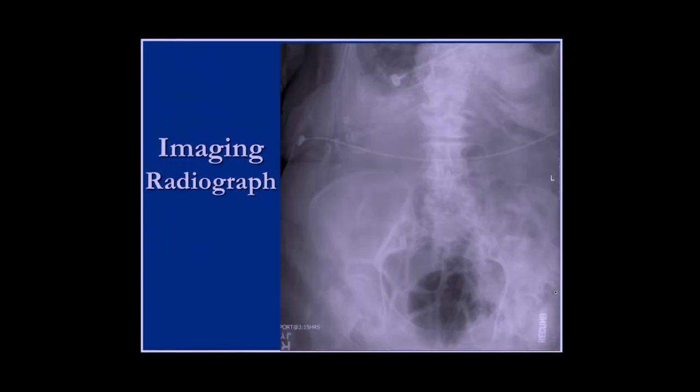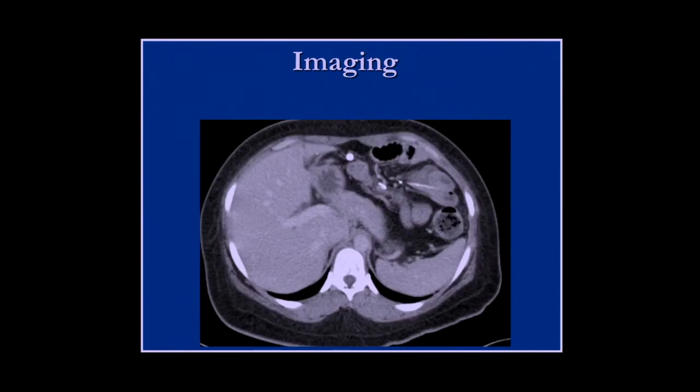So let's go through an imaging sequence of the body using each of these techniques. If you just do a straight X-ray, a lot of overlapping structures, and you see the white of the spine, bowel, outline of the hips, and so on. Not a lot of detail. So let's move on to the next step. X-rays again, but this time it's the CT scanner, which has very good spatial resolution, and you remove overlapping structures, and lo and behold, you see the same thing you saw on the regular anatomic specimen. Stomach with fluid in it, liver and spleen, and what else do we have here?